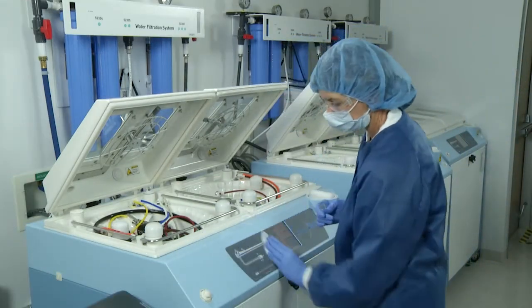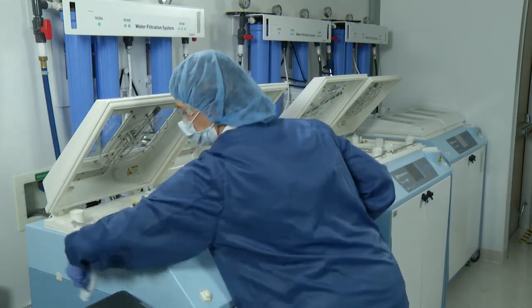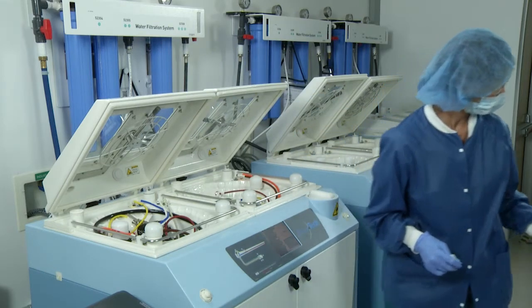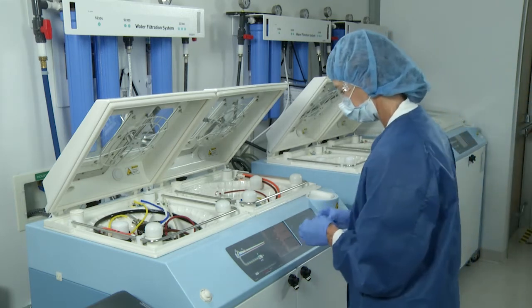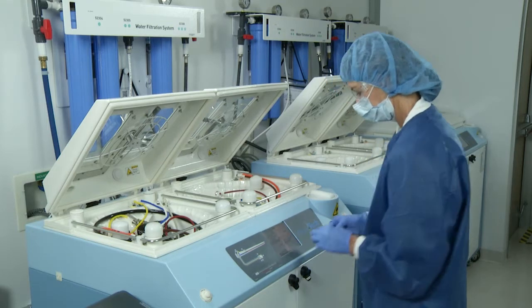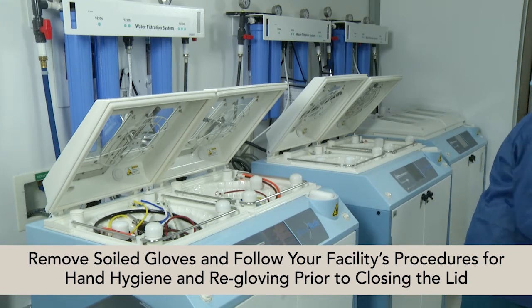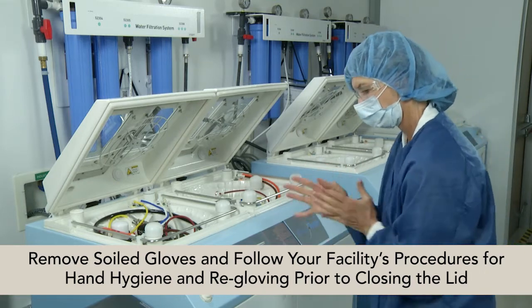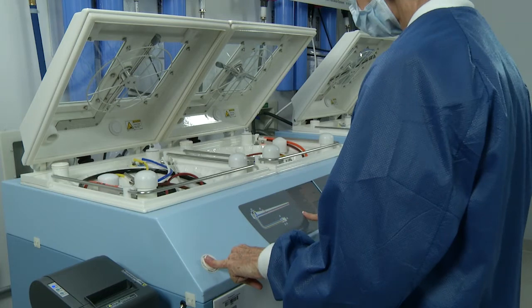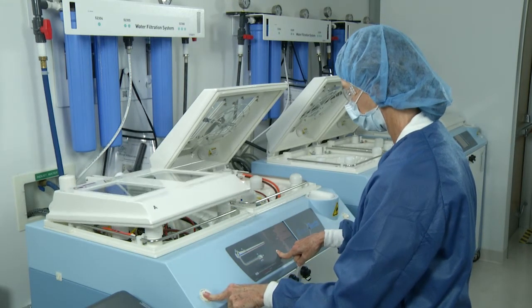Wipe any exterior areas of the EVOTECH with alcohol-based wipes, as it may have come in contact with a dirty scope. Simultaneously touch the close lid button on the touch screen and the close lid button on the front panel for the basin use. The lid should close completely. You will hear an audible sound as the lid seals.